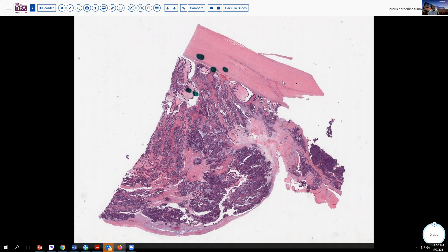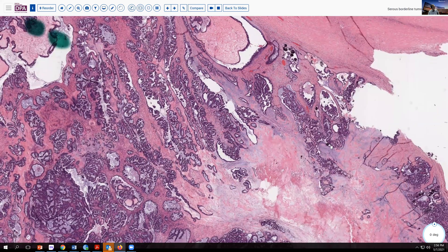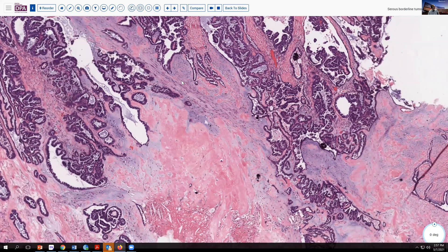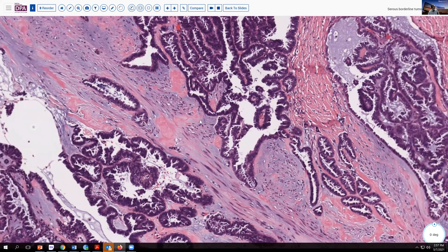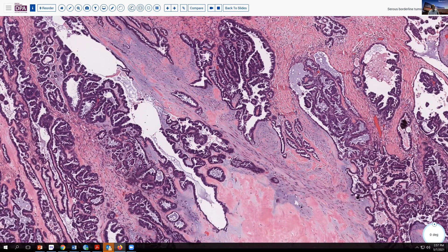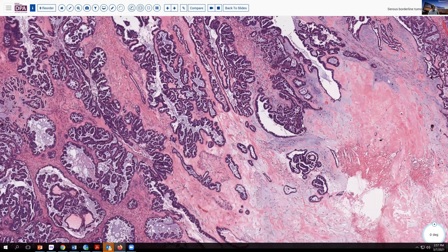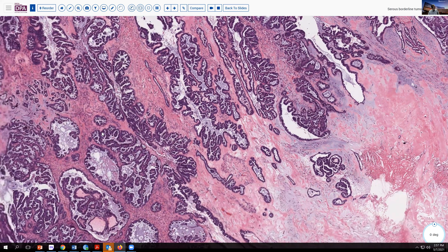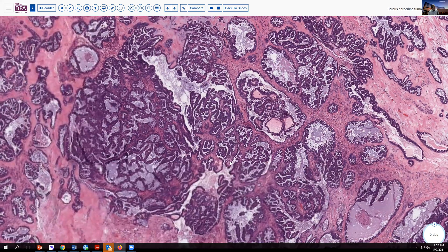In this particular patient, this was our lesion. As you can see, there are some solid areas. There were large cystic areas, and the wall was somewhat fibrotic. We can see at low power there's some complexity to the microscopic appearance. We have smaller cystic spaces lined by a cuboidal and papillary-type epithelium. At low magnification, we might say right off, this looks like a low-grade serous tumor, and most likely we would be thinking of a borderline tumor. This sort of morphology with micropapillary pattern ought to alert us to that possibility right out of the bat.